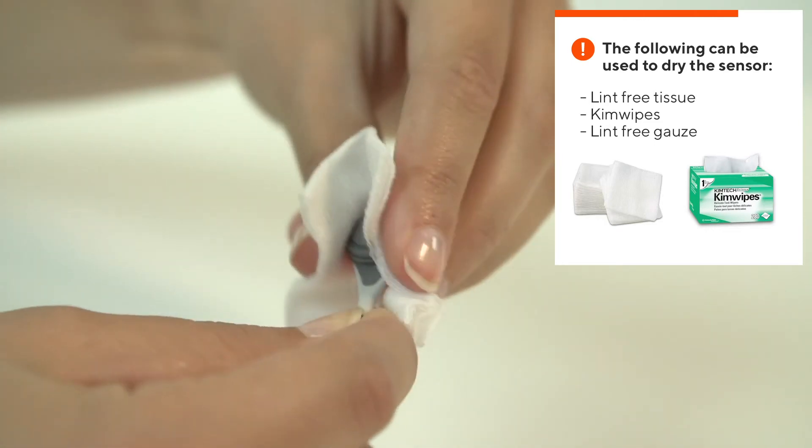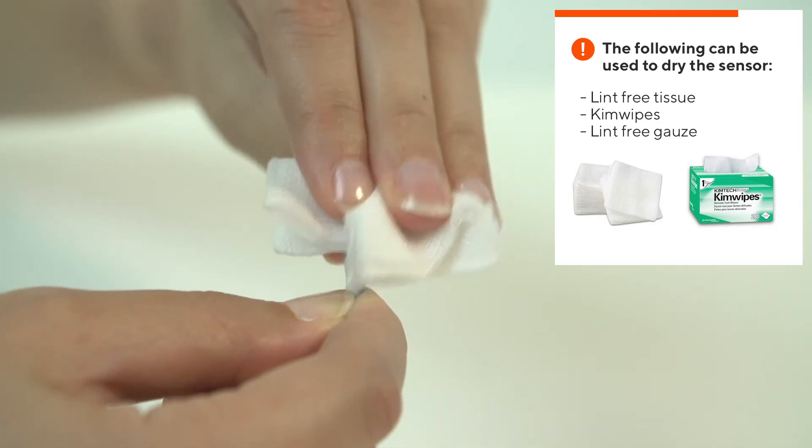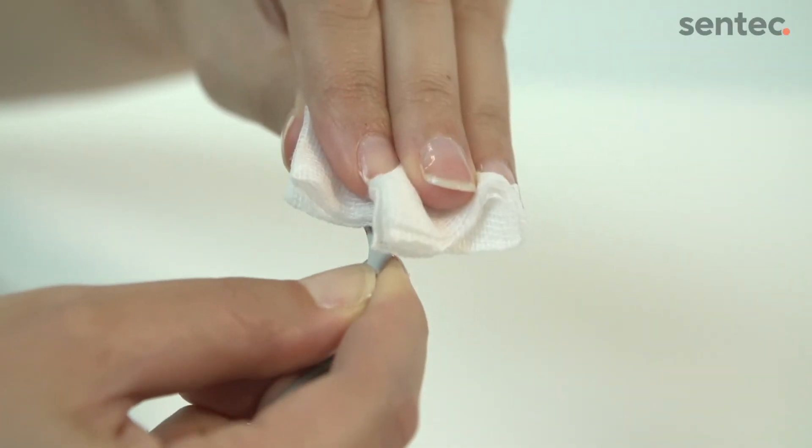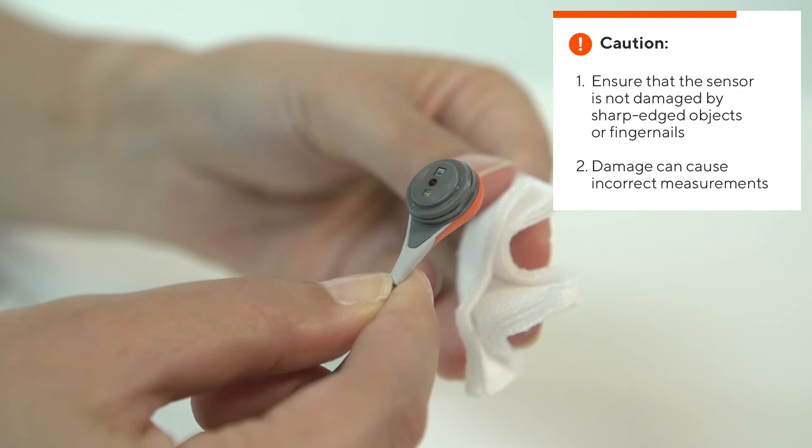Dry the grooves around the sensor with clean, lint-free gauze and make sure there is no gel residue remaining in the grooves. Gently tap the gauze on the sensor surface to dry. Do not rub the sensor surface.